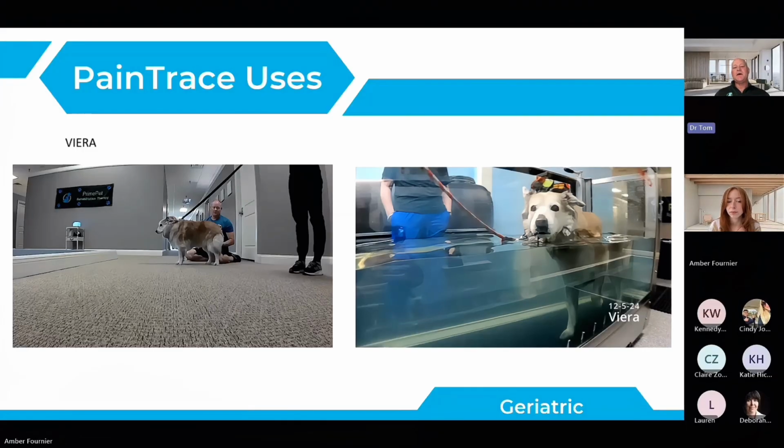And then you're not on the spot when an animal is being fidgety and the whole deal. So we use that as a door opening. And then we really pick some very chill dogs that are very easy to work with to ease them into it. But after a few scans, they're able to take the lead because they know they're not going to hurt the animal. They also feel very comfortable to be able to just move forward with it. And they love the idea.